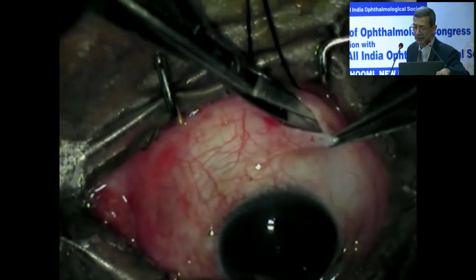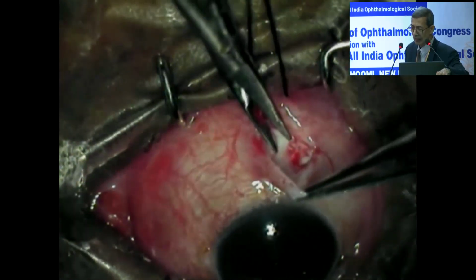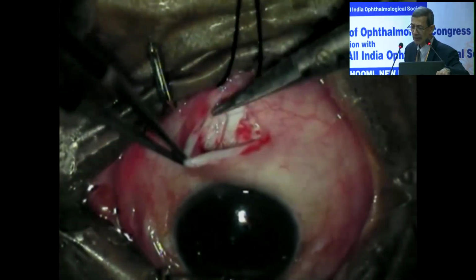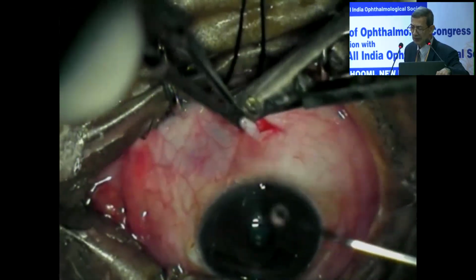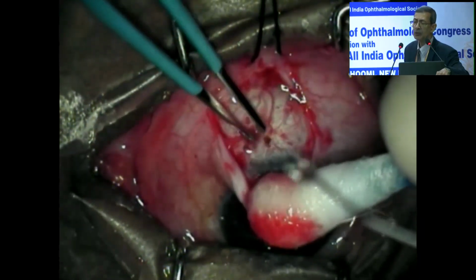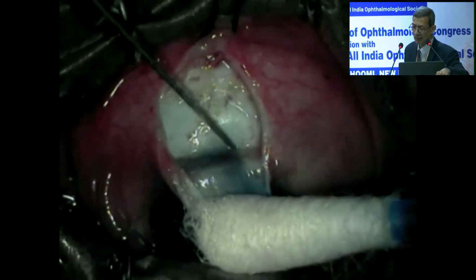An incision will be given to incise the conjunctivo-Tenon layer on each side of the entry point. The Tenon's capsule is being dissected, and then the other side incision is given. The way I do the incision is as seen here, about 6.5 millimeters from the limbus, just in front of the superior rectus insertion. Superficial cautery is done to cauterize the episcleral blood vessels.